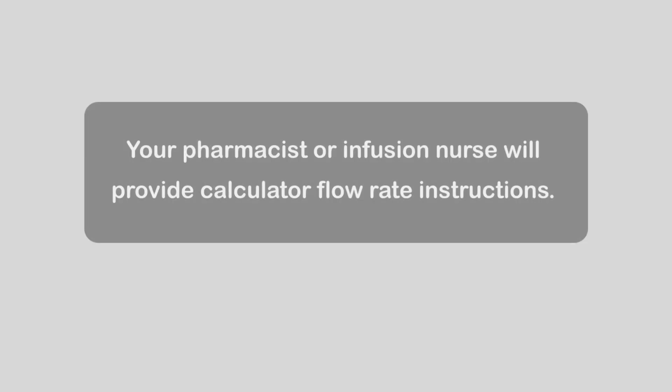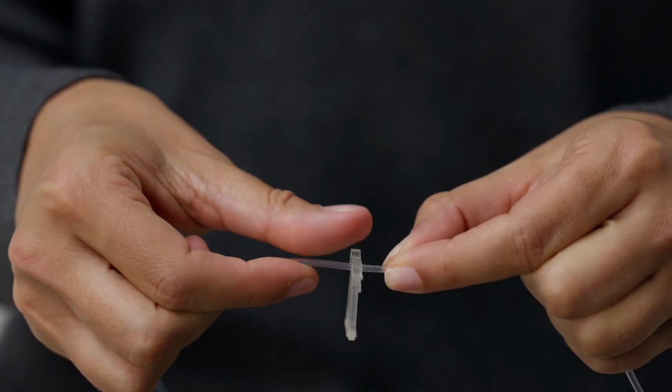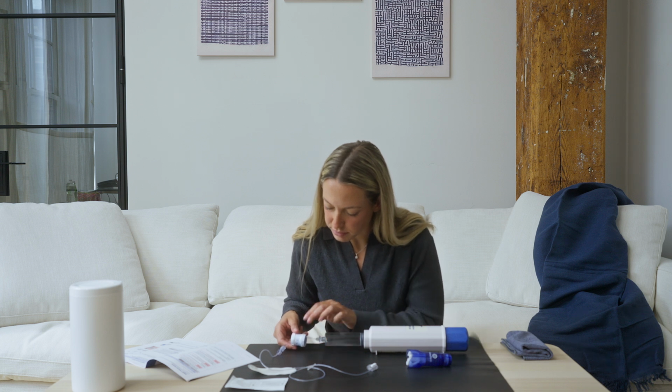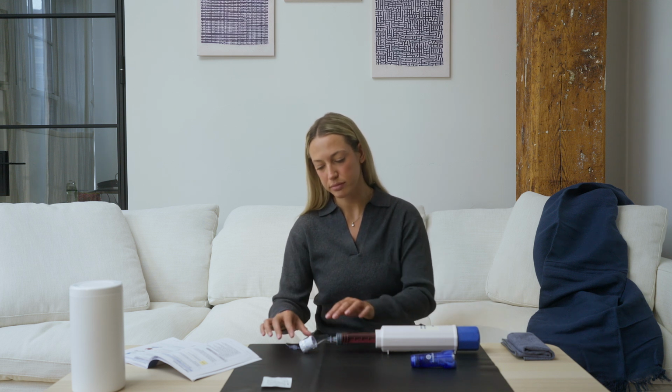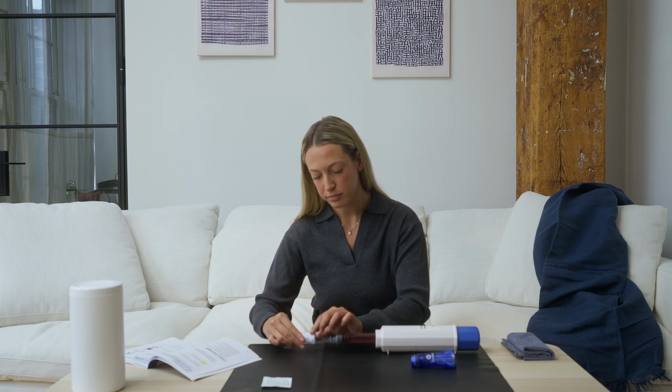Your pharmacist or infusion nurse will provide calculated flow rate instructions. If you use an InfuSet, open the slide clamp, which will allow the fluid to flow. If using a VersaRate controller, simply turn the dial to the appropriate number as advised by your healthcare professional to start the infusion. You can monitor the infusion by viewing the syringe volume. After the infusion is complete, or if you need to stop the infusion for any reason, turn the dial to the off position or close the clamp.